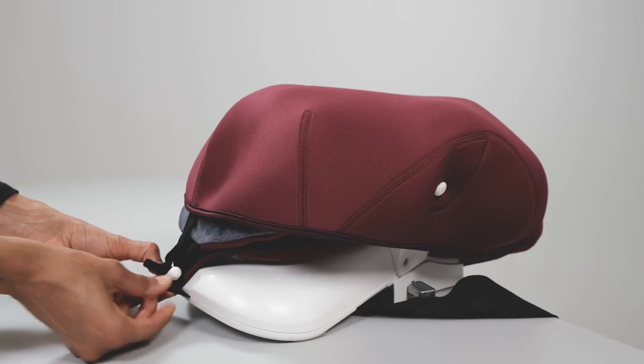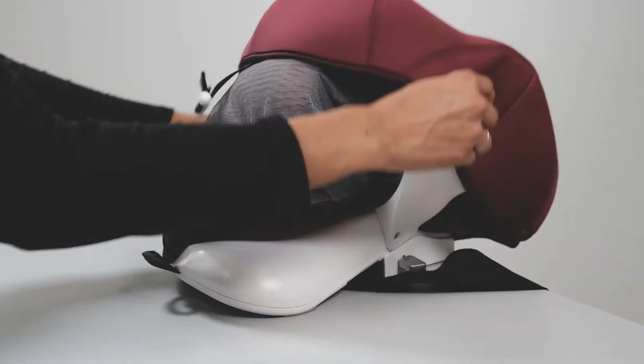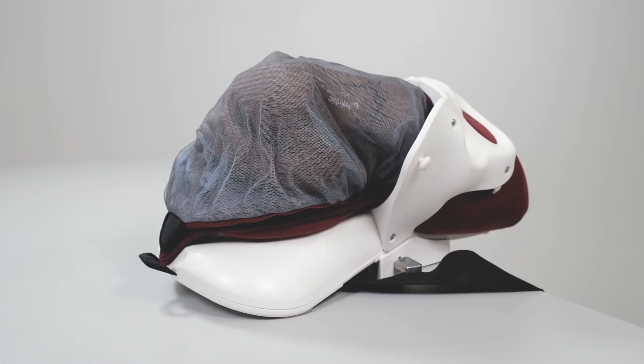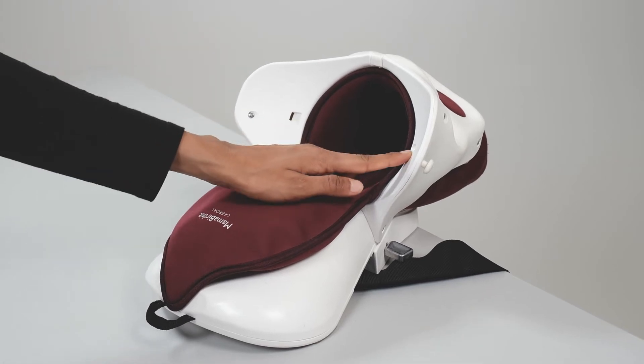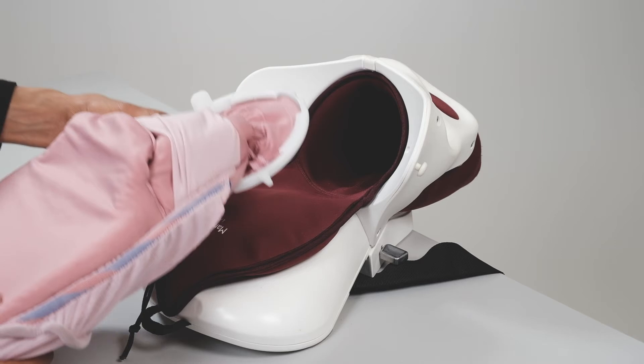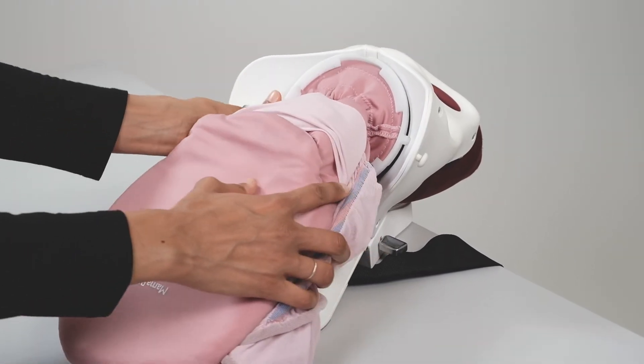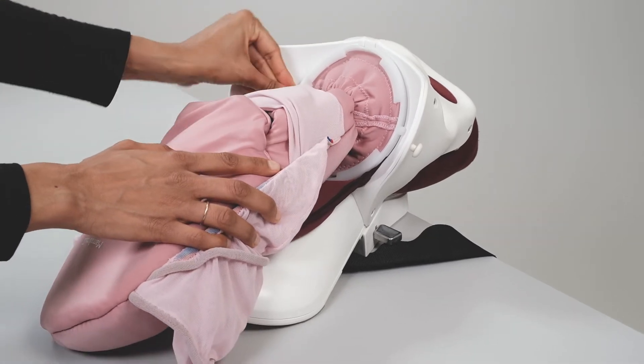To set up, first remove the abdomen skin from Mama Berthy. To connect the CS uterus to the pelvis, insert the round peg into the round hole on the right side of the pelvis. Press the ring down on the left side until it connects to the pelvis with a click.